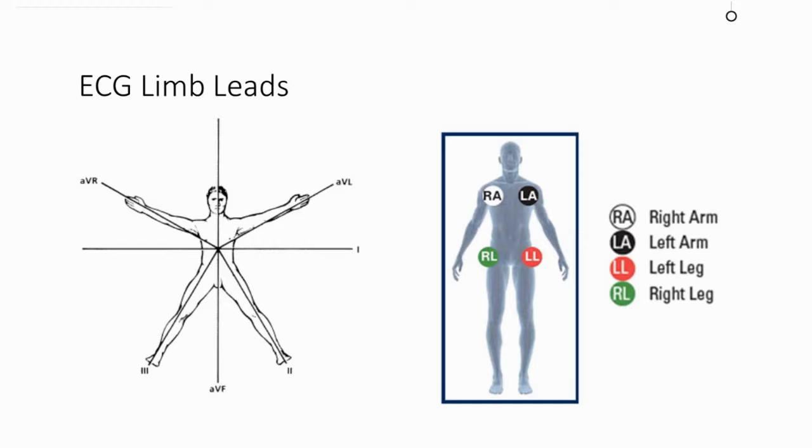Yes, and I think that's a very good point, because before you begin to analyze both normal and abnormal EKGs, it's very important to understand what the EKG means and represents. The leads have to be placed properly in order to create the right way of looking at the electrical system, especially from the vectorial approach, which includes both magnitude and direction.